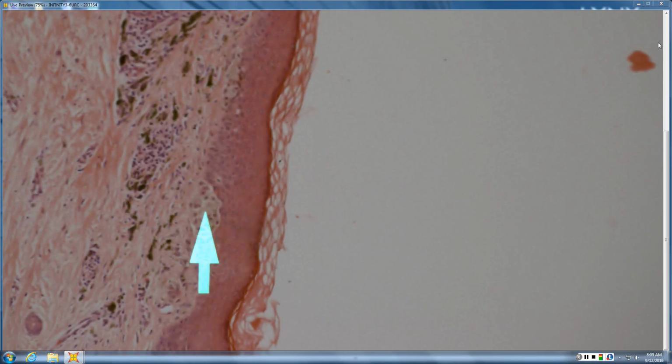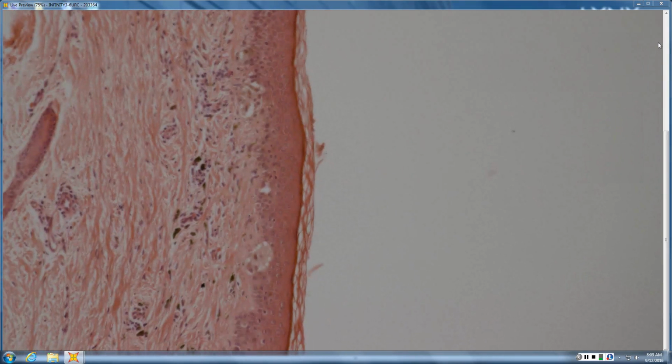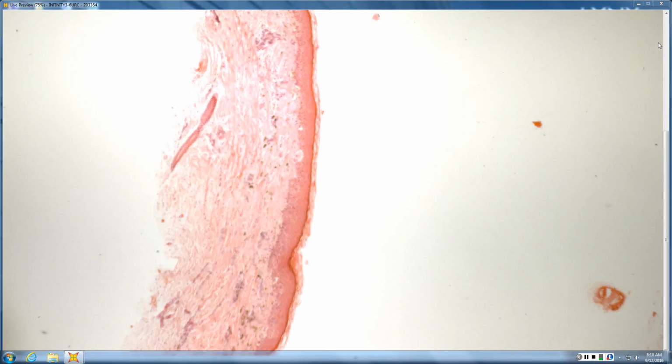They vary in size, they vary in shape, they're not equidistant from one another. Great in music, lousy in melanocytic lesions. And do you see areas where you have non-nested melanocytes at the junction? Yeah, there's some single cells. So you have a proliferation of non-nested melanocytes. You have nests that vary in size and shape that are not equidistant from one another. Do you have a normal rete pattern, or is it effaced? Yeah, I'd say it's effaced. So I'm thinking melanoma in situ. So all of that suggests melanoma in situ.